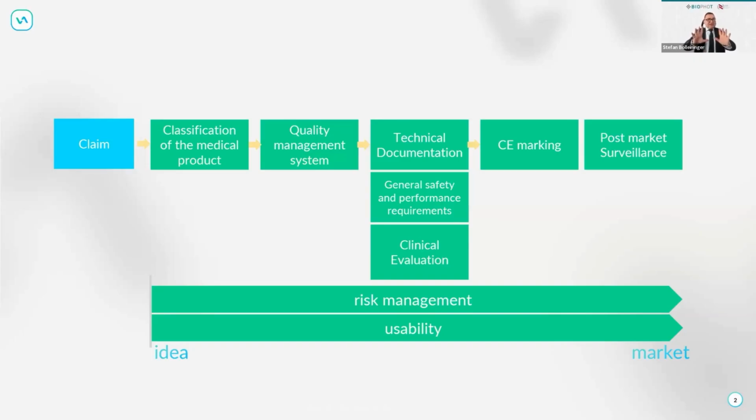So that means we need to control input to output, and we need to control how it is created instead of verifying what will be the real outcome, because that is statistically not easily possible. That's why the same basic procedure still applies. Everything applies in the same format as it was: risk management, usability, GSPR, clinical evaluation, you name it, all applies. However, it applies now in a different sector, in a different way, and with a specific angle.